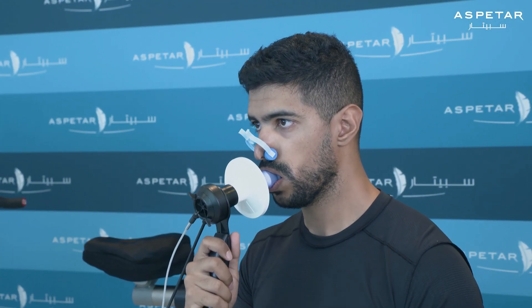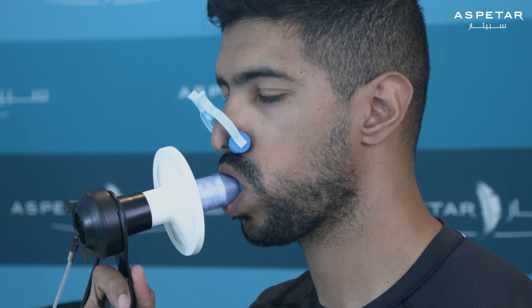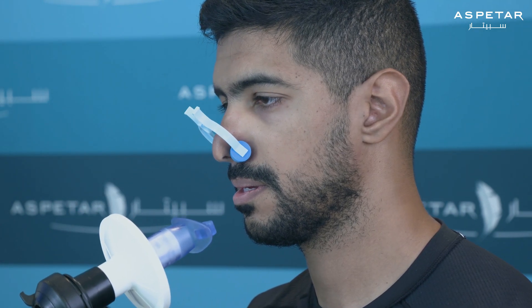Finally, you will continue to breathe as normal. The test should be repeated two to three times with proper technique to ensure accurate results. Once these steps are complete, you can then remove the mouthpiece.